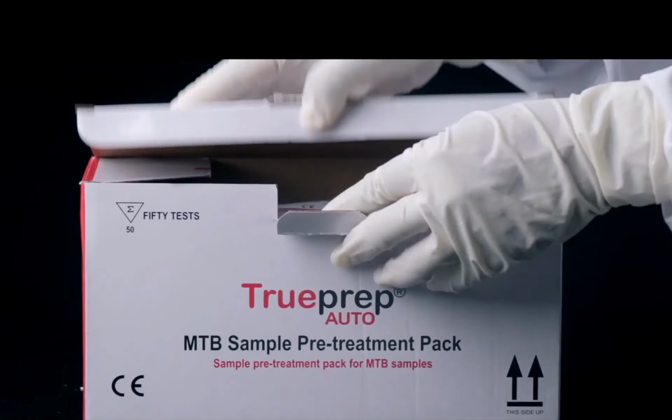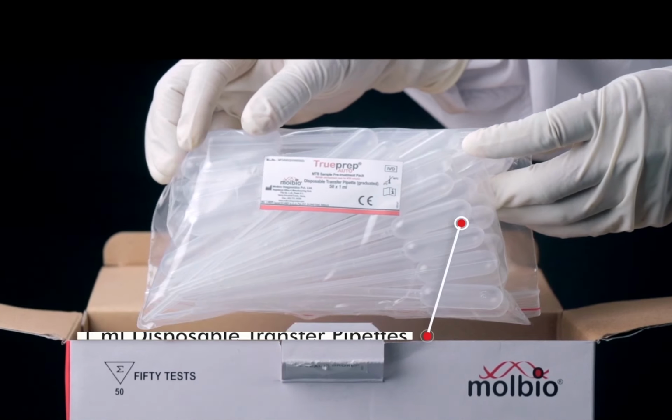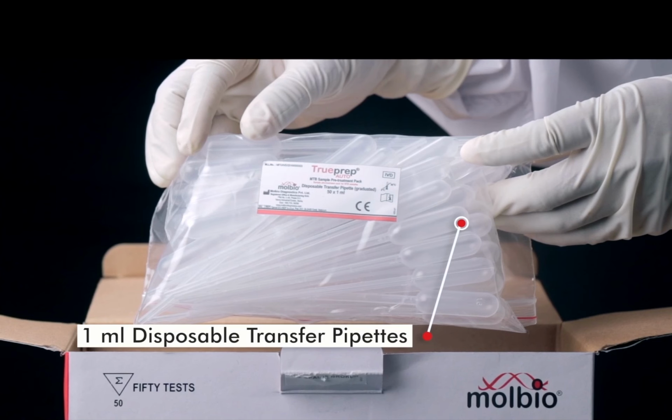Now, what are the TrueNat consumables? The first thing you get after you receive the sample, what all things do you require? The first one is the pre-treatment pack for the MTB sample. Here you can see the TruePrep Auto MTB sample pre-treatment pack. What all is there in this? Here you can see it is marked for 50 tests. First you get 1 ml disposable pipettes.